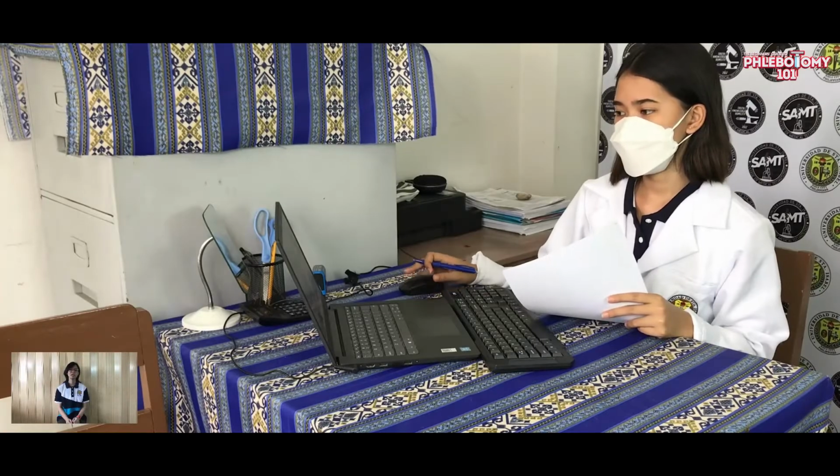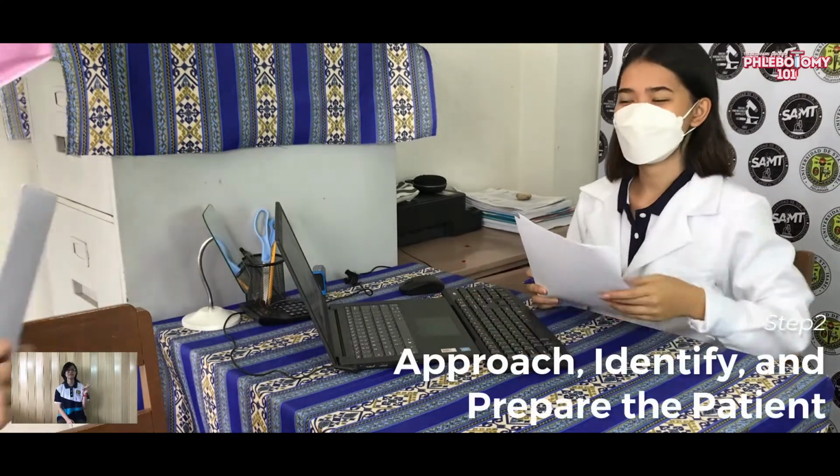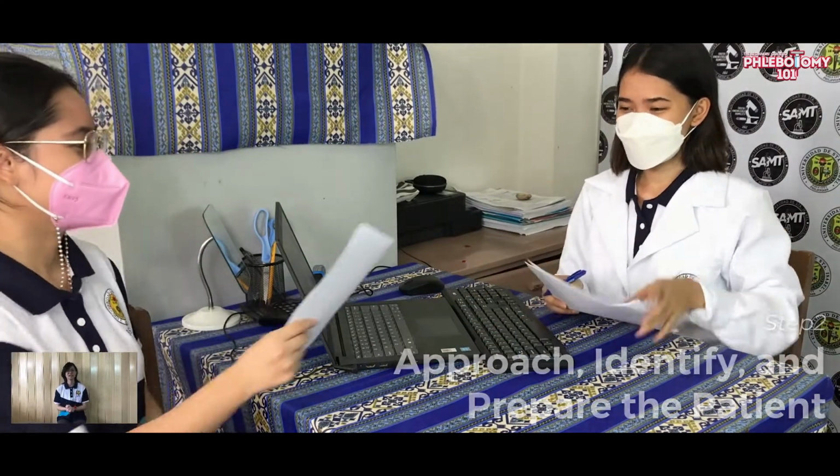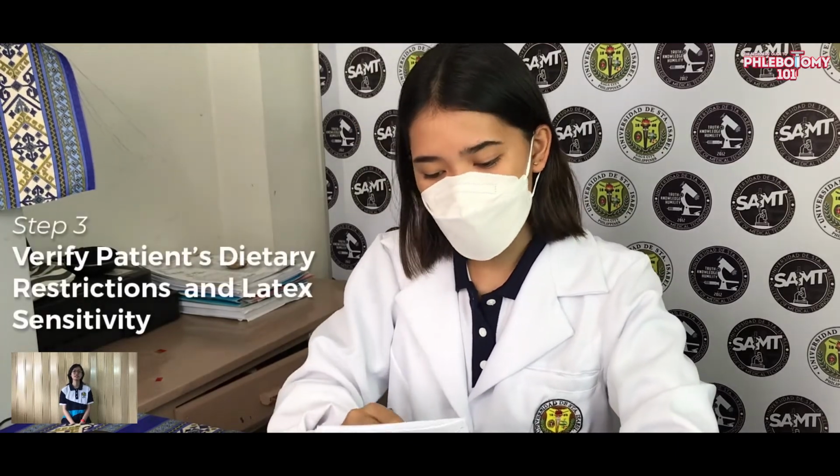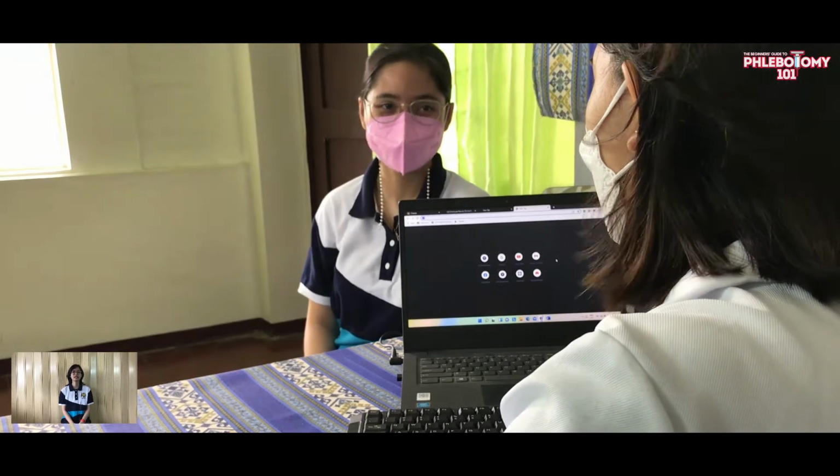The second step of the venipuncture procedure is to approach, identify, and prepare the patient. And yes, kahit pa-lab people tayo, kailangan natin ng communication skills kasi kakausapin natin ang patient primarily to confirm their identity. Remember, the misidentification of a patient and the mislabeling of a specimen is a very big no-no to our field. For the third step, we need to verify the patient's dietary restrictions and latex sensitivity. Siguraduhin latex-free equipment ang gagamitin sa patient and walang latex items sa room kung ito man ay allergic sa latex.